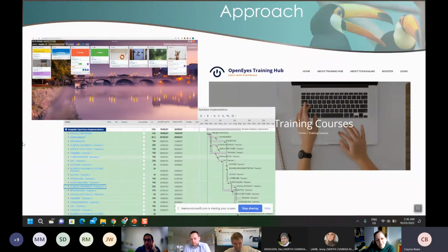We have about 50 different LDAP directories that we're connecting to, and some are LDAP, some are other formats. So that's possible. There is a multi-tenanted version. However, there's also a multi-tenant light, which I think for your purposes should be okay. You have a picking list of different LDAP directory servers that you can connect to.